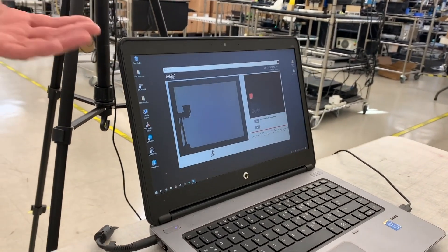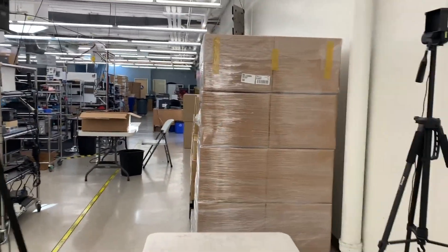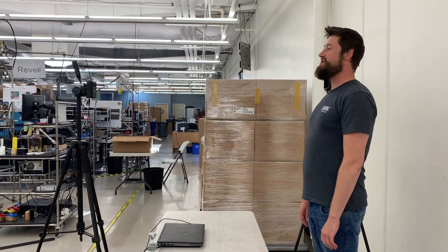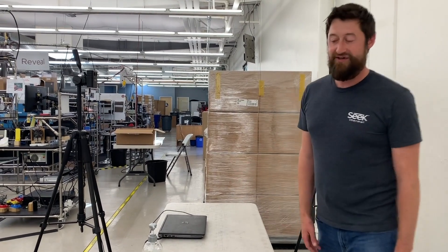Another alternative, since it is just running on a Windows PC, is to do nothing when the lid closes on your PC. Now you can come in, step into the frame, get your analysis done, and then hear the audible sound of your pass or fail. So there are some different variations of how you can configure the system.